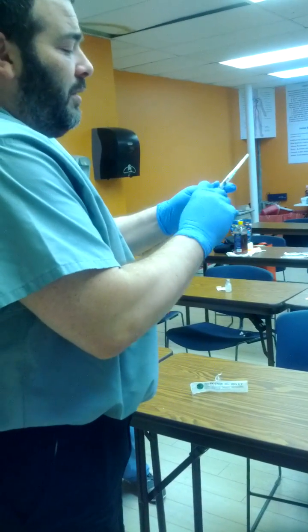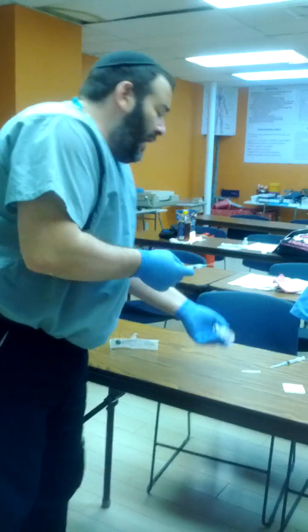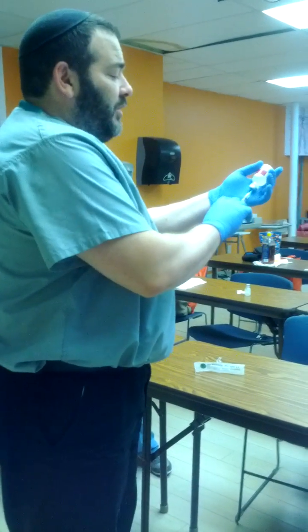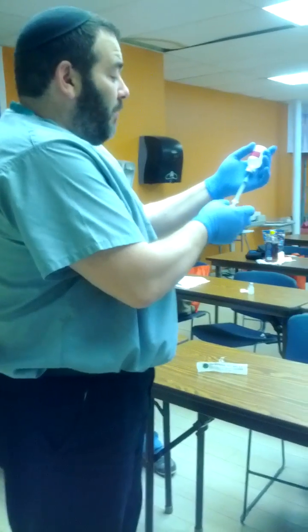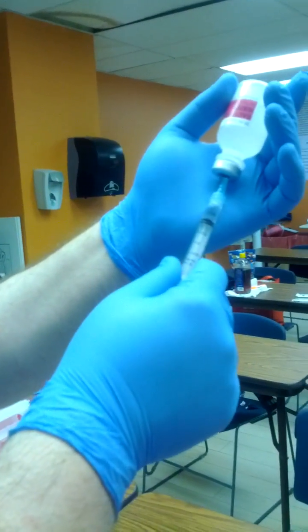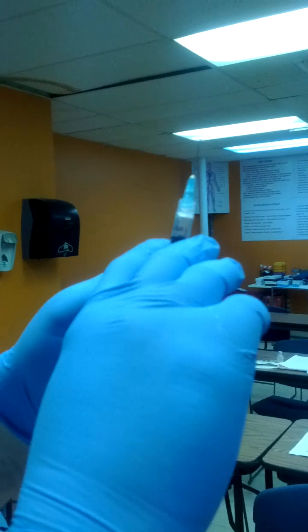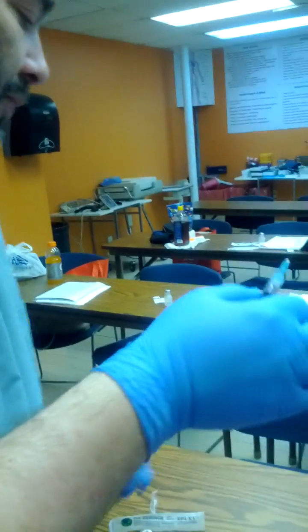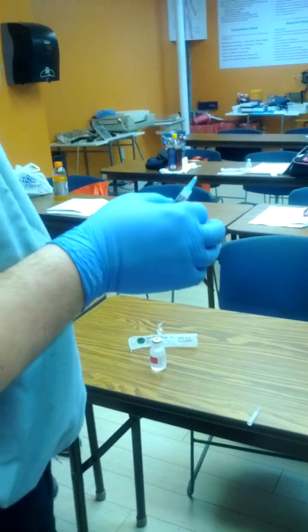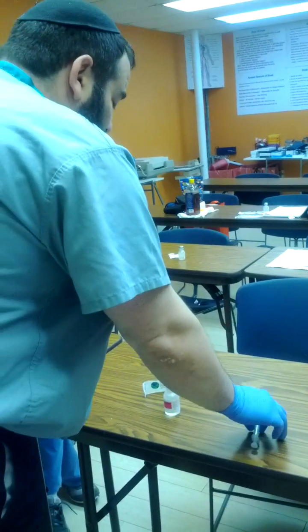I'm going to move the plunger back and forth to loosen it up a little bit. Make sure the needle is nice and tight. Now I can see the top of the vial is dry, and at this moment I can take my needle, inject a little bit of air inside there, making it easier for us to extract fluid. If you look closely, just because I put a little air in there, the plunger is moving out and back all by itself. I'm going to take the amount that I need. You see there's an air pocket and a small bubble — I'm going to get rid of it by tapping it gently, not too hard, and all my air went up on top. I'm going to get the extra liquid out and stop at 0.5 cc's for this injection, which is what I will want you to fill up your syringe. We do not recap the needle after it's been used, but before it's used I can put my cap on the side and put the needle inside just like this, so as to make sure not to poke myself with the needle.